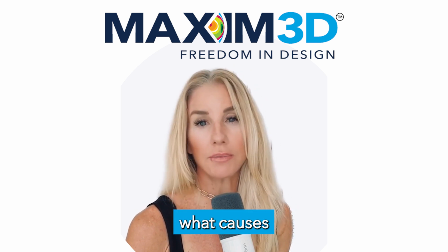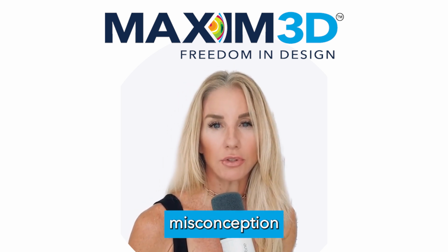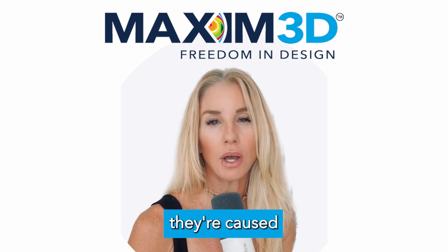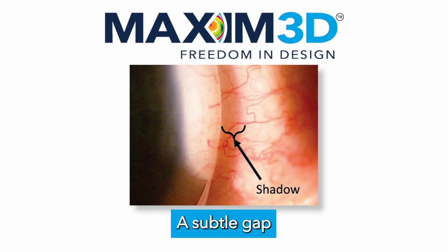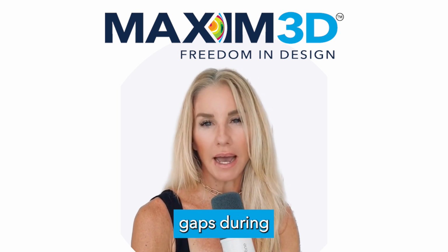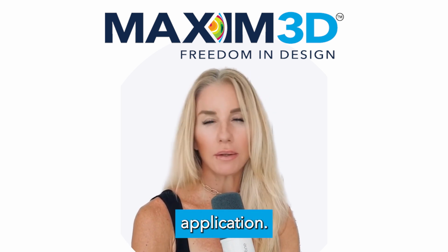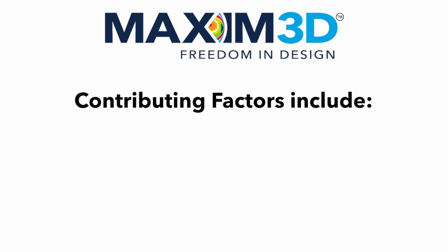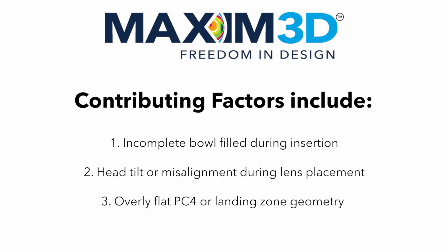Here is what causes bubbles. It's a common misconception that bubbles result from a centrally steep lens. In most cases, they're caused by edge standoff, a subtle gap between the landing zone and the scleral surface, or from improper insertion technique. Air enters through these gaps during or just after application, typically from a quadrant that isn't properly aligned. Some contributing factors include an incomplete bowl fill during insertion, head tilt or misalignment during the lens placement. Lastly, overly flat PC4 or landing zone geometry.